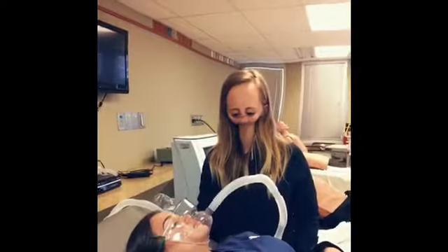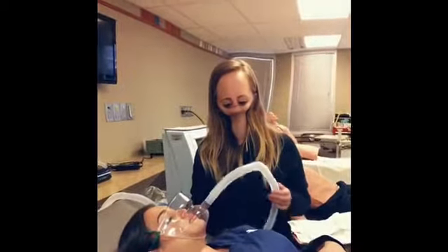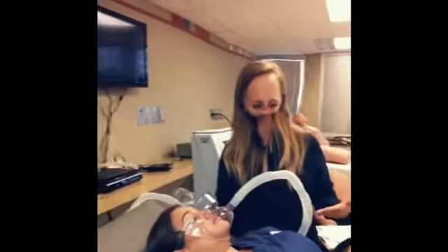Assessment of need. Face tent used to deliver humidified oxygen or air to patients who cannot tolerate a simple mask.